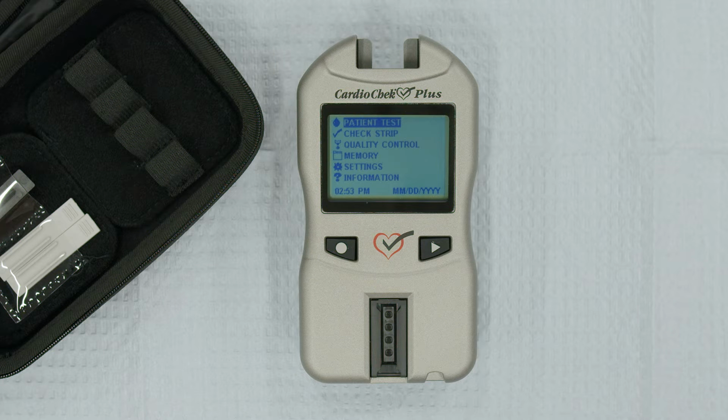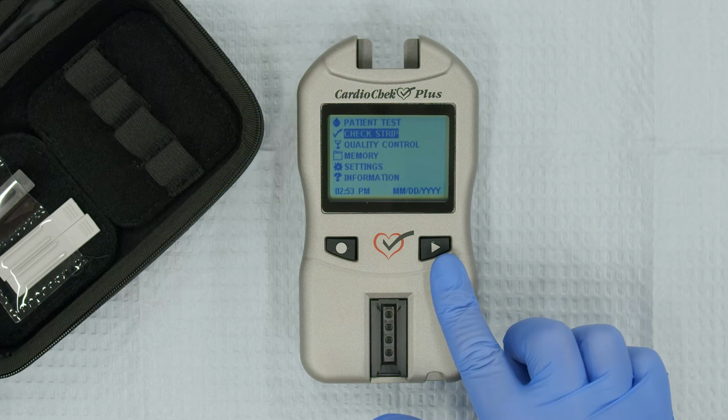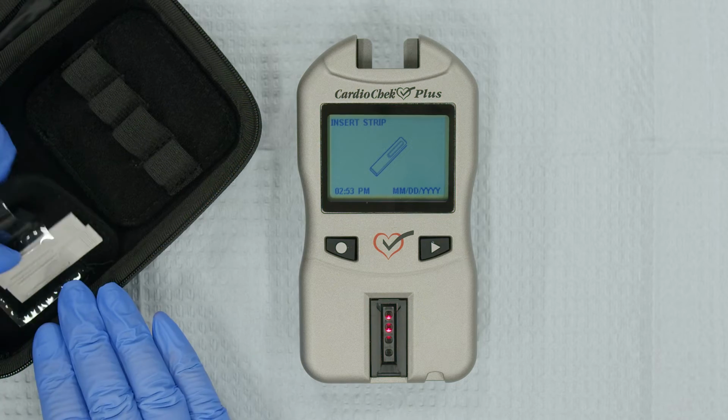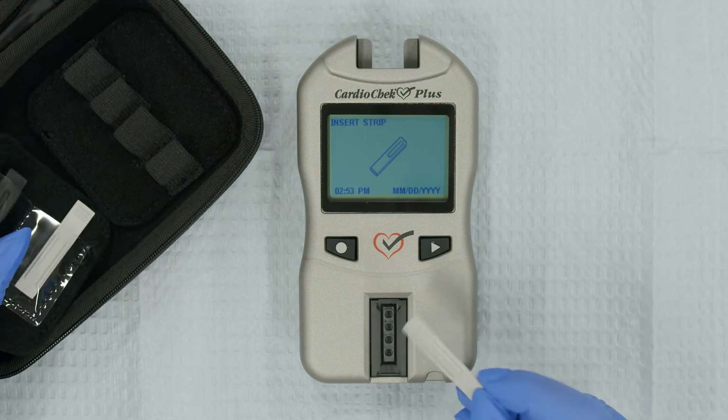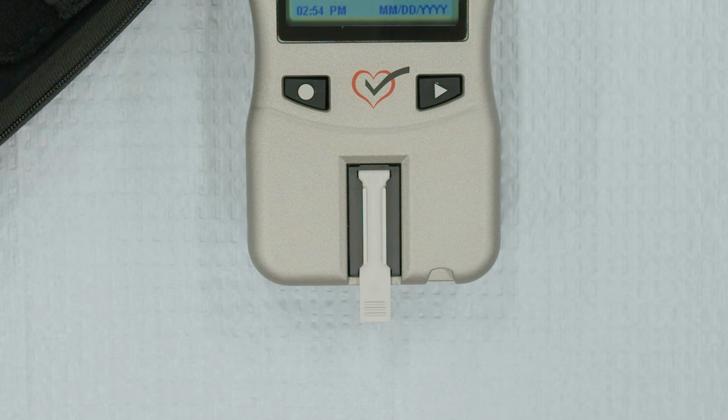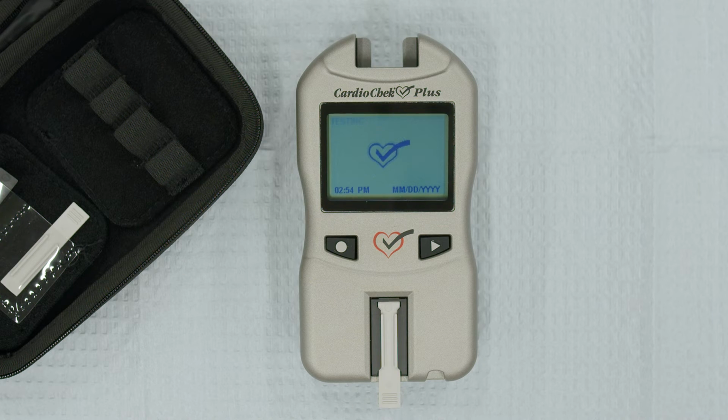From the main menu, press Next until Check Strip is highlighted and press Enter. When Insert Strip appears on the screen, insert the gray check strip ribbed side up into the Reflectance Test Strip slot. Do not move the analyzer during testing. If the analyzer screen says Passed, good news! You're ready to run controls.